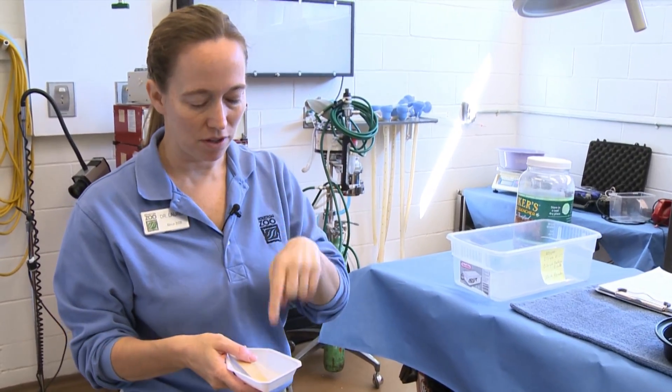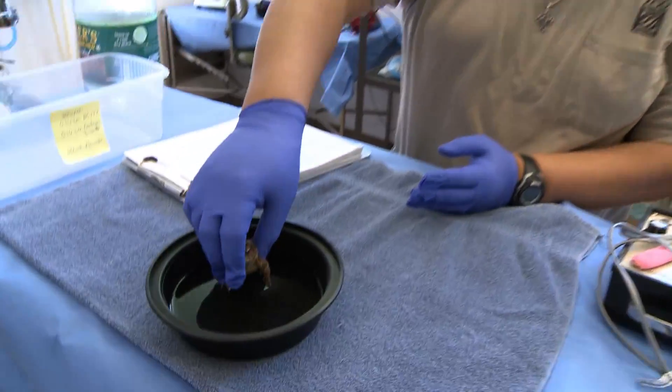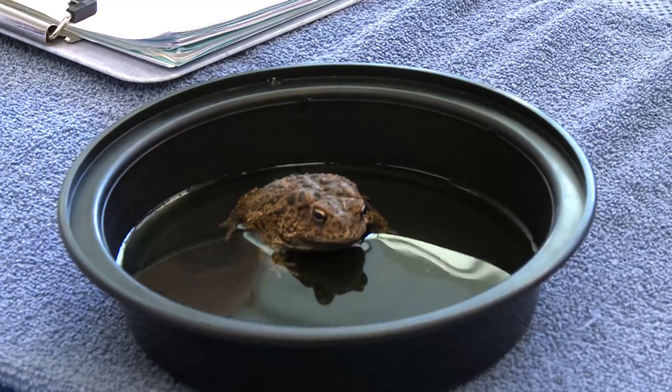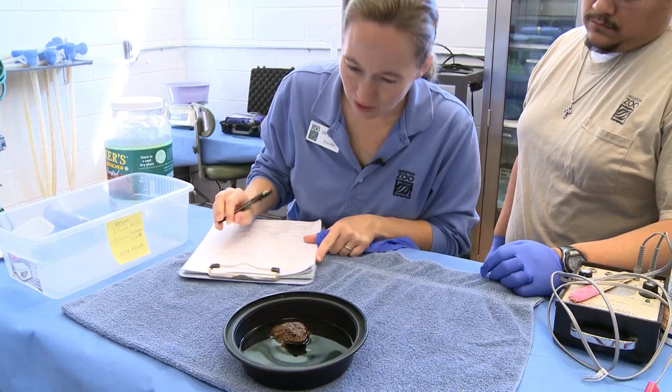We mixed anesthetic powder into this water, which is the special reconstituted water that we keep our toads in, so this is now anesthetic water. This is our patient and we're starting him at 10:08.